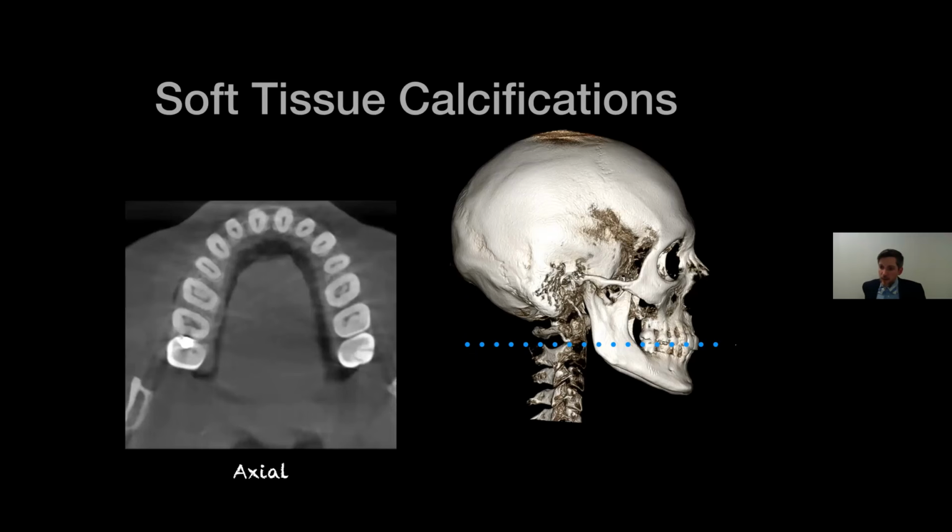How close to the mandibular canal are impacted third molars that are not worth extracting? That's a really good question.